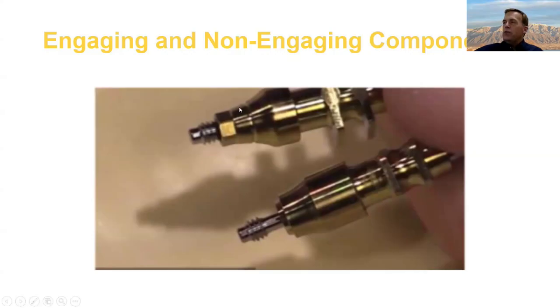The engagement between the abutment and the implant is what makes the case stable long-term or not. All the screw does, and we'll talk about this in a minute, is hold the two parts together. So we'll want to use an engaging part for any of those situations. Really, the only time you're going to use a non-engaging part is for multi-unit cases.